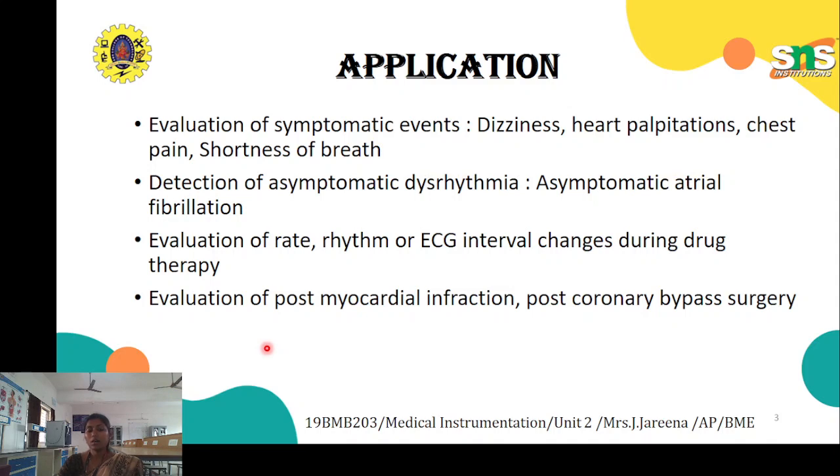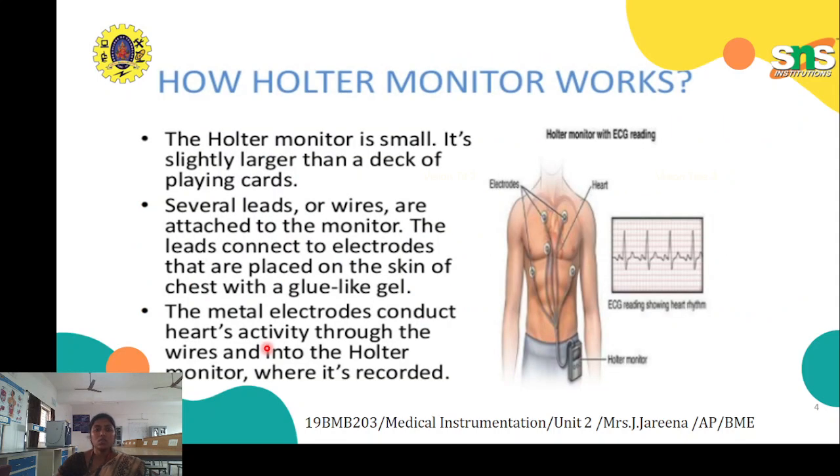In that case, the Holter monitor is recommended to monitor heart rate activity, to see whether everything is fine with the patient before they are discharged. These are a few applications where the Holter monitor plays a very important role in giving proper treatment. Next, we will see how the Holter monitor works.